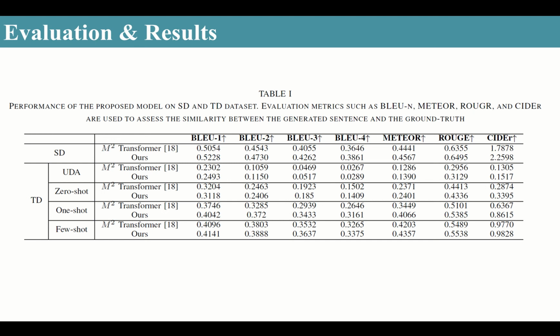Table 1 shows the overall performance of the proposed approach with validation and the domain adaptation settings. All target domain experiment settings share the same validation set, and we just use a different number of training examples. UDA means unsupervised domain adaptation. The model is trained on the source domain and evaluated directly on the target domain.